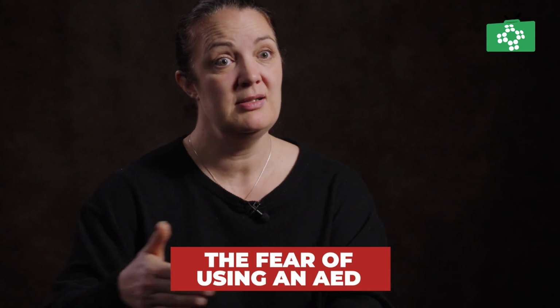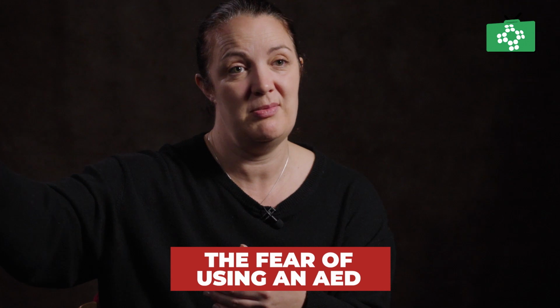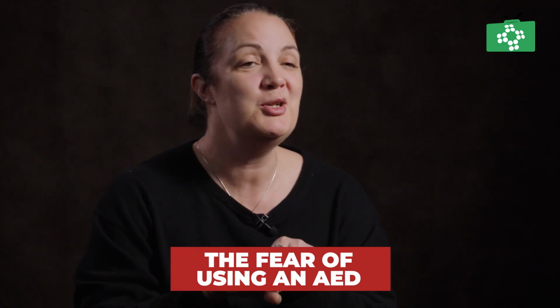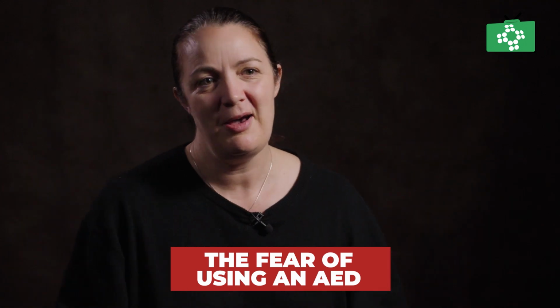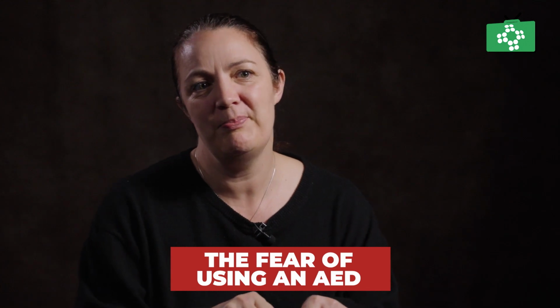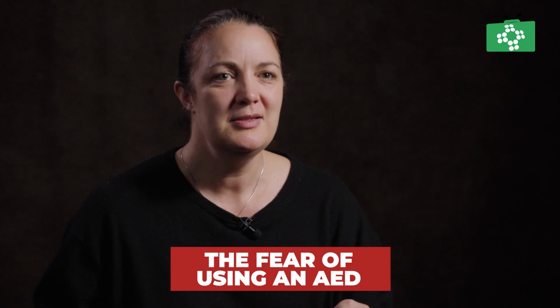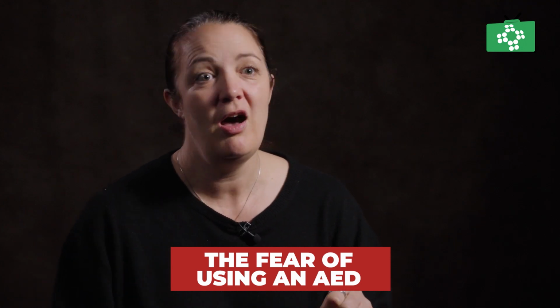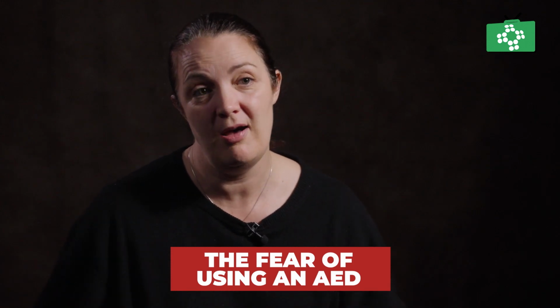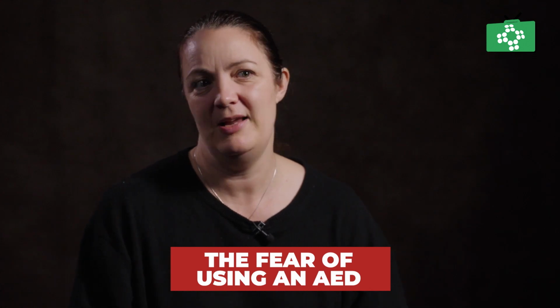We were taking it in turns to do chest compressions, and luckily the dentist whose surgery was in the car park walked towards us holding the defibrillator, and it was during COVID, so they were fully covered up in PPE, and several members of the public that were there were like, oh, I don't know how to use it. And I said, please don't worry, I'm a paramedic. I've never used a public defibrillator either, but the most important thing is that we open it up, get the pads on, and follow the instructions. And that's exactly what we did.